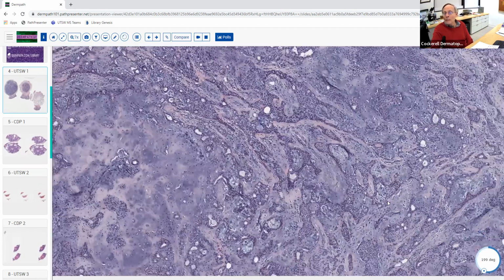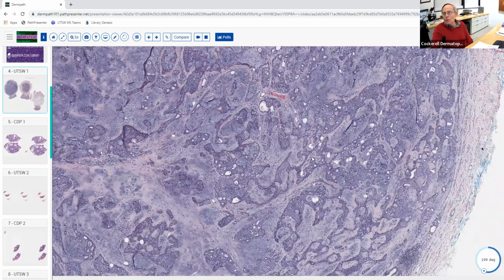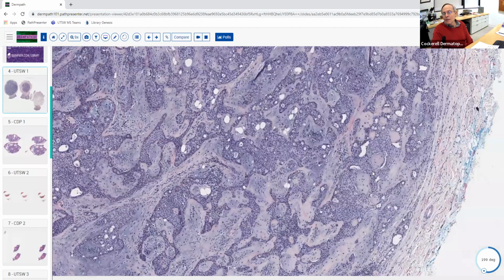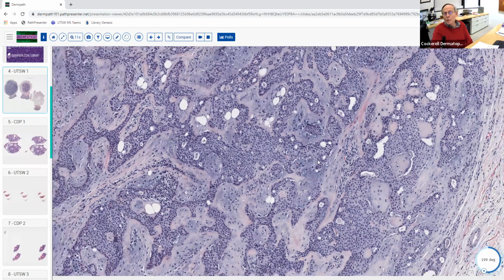Now there's one other lesion that can look very similar to this that's not in the skin. It's so-called pleomorphic adenoma, or mixed tumor of the mucosal surface. So you get a lesion in the salivary gland. It can look exactly like this. Looks virtually identical to chondroid syringoma, or mixed tumor of the skin that's on glabrous skin. So just be aware of that.